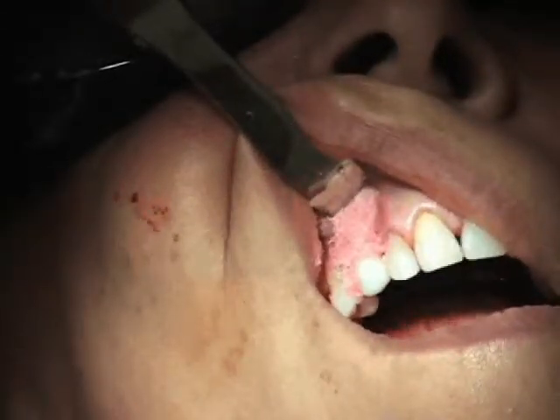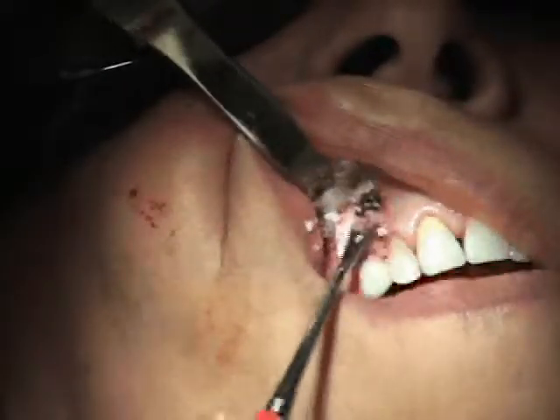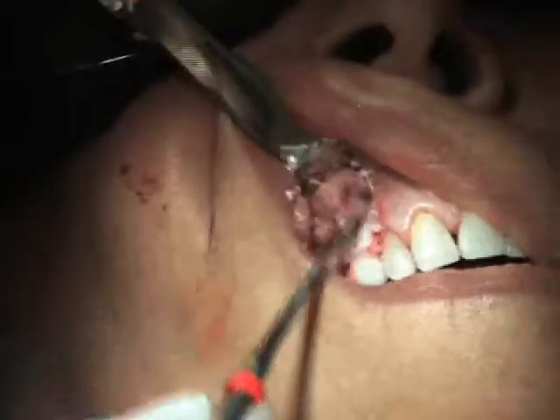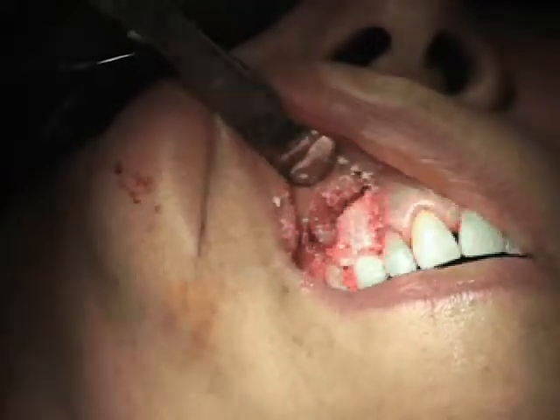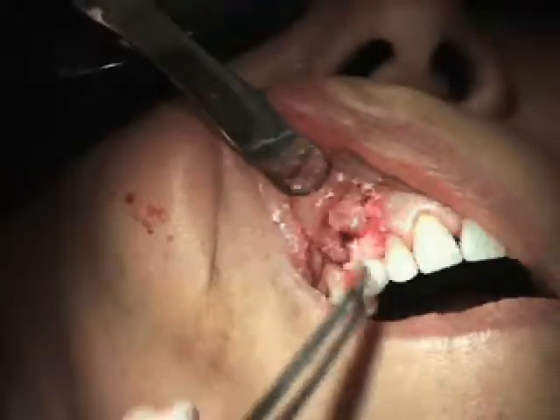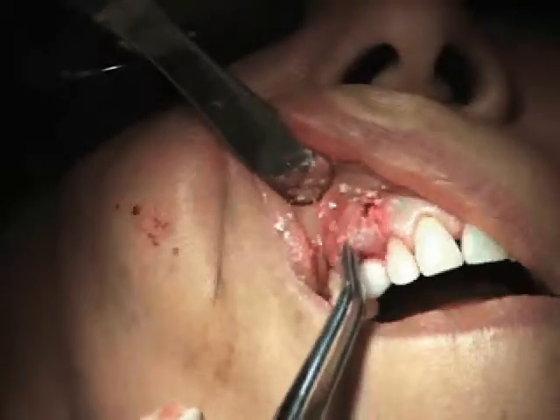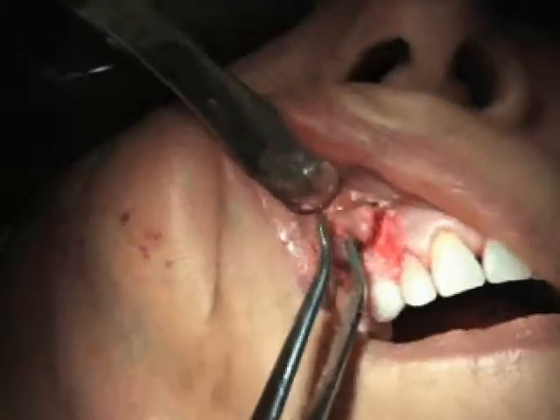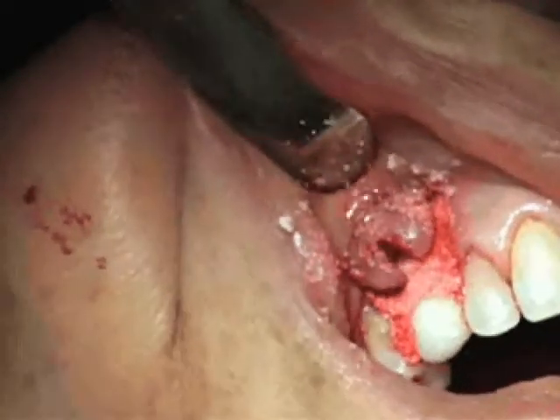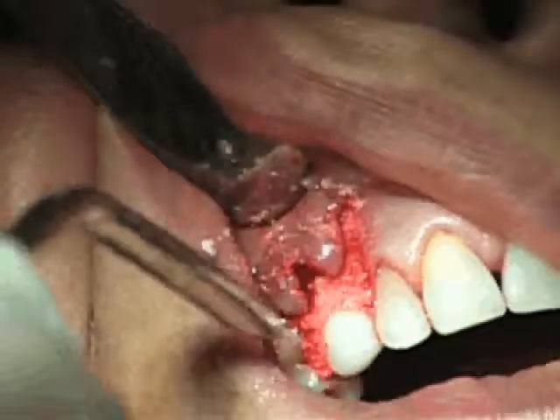Okay, we're almost done. I'm going to bring this up — that's pretty well already released. I don't have any pressure on that flap. But if this was under pressure, I would go in and release the flap. When I took off that granulation tissue, that pretty much released the flap. I'm going to clean up the graft a little bit proximally — you're not going to get bone to grow up that far — and then just clean up the flap and the edges of the flap.